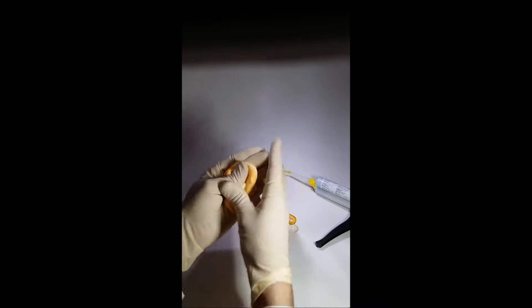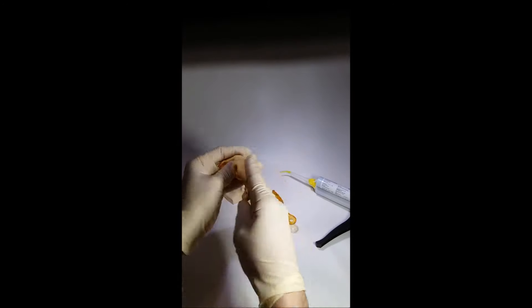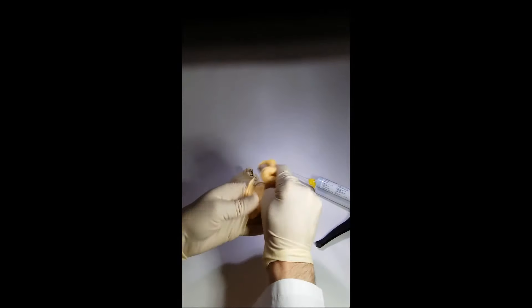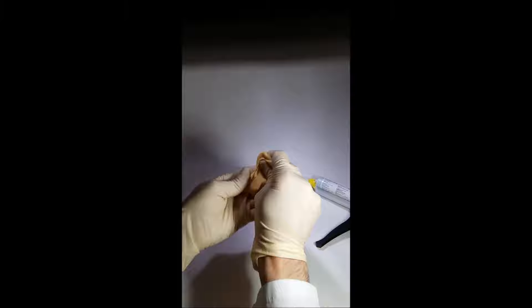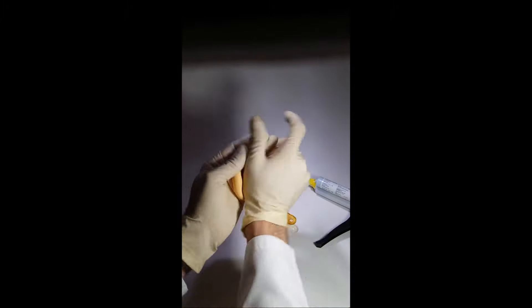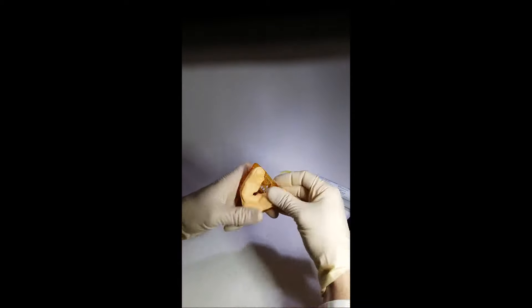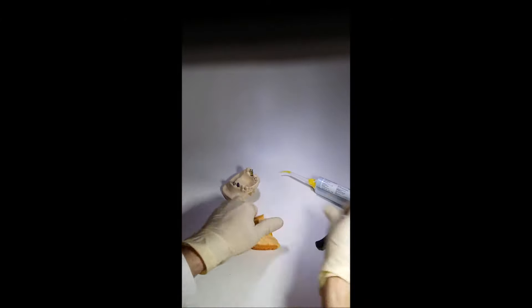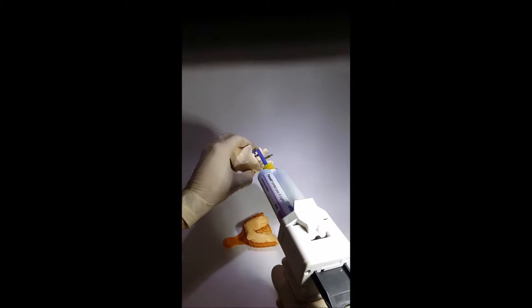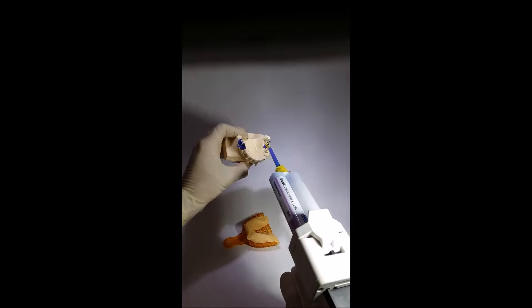Now we will demonstrate how each technique works. Let us knead an impression paste — we should do it quickly so the paste does not lose its elasticity. Apply a correctional paste on the implant collar with a syringe, then put the impression tray so we can see the transfer screw through the impression paste.